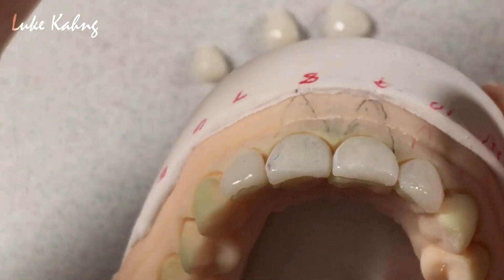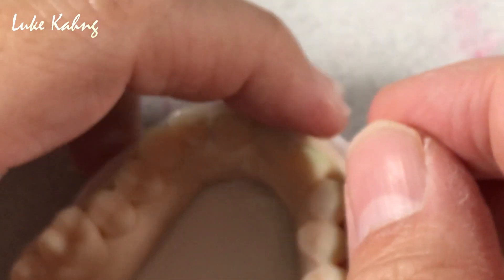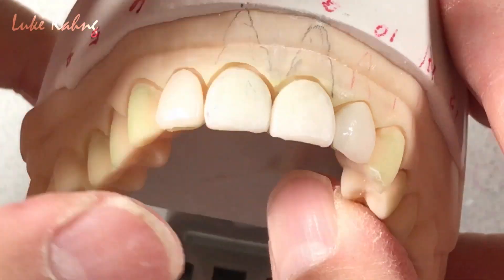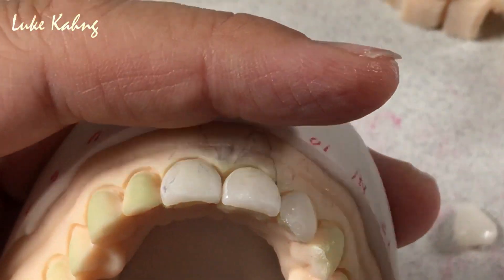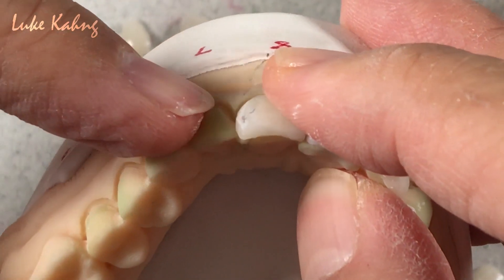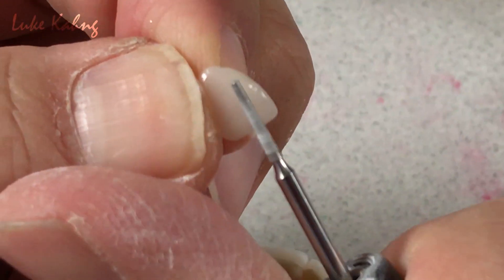So I use this — that's about it. Now this one I can flatten because it's too narrow. I have to make it bigger. So, the key is here: we have to bring it out as much as possible. But this one you can add more facially as well. So like I said, I can trim it facially.